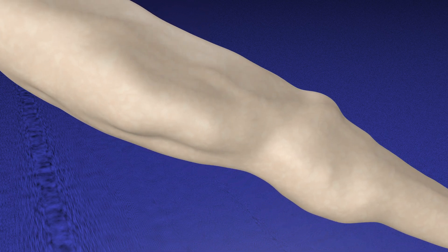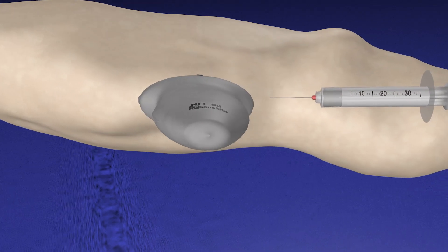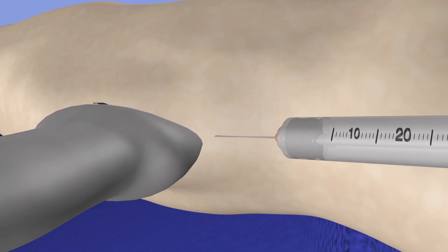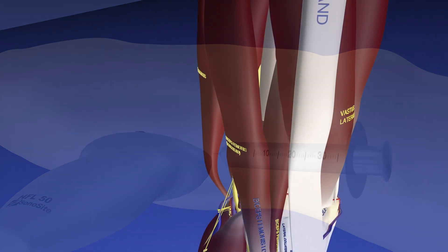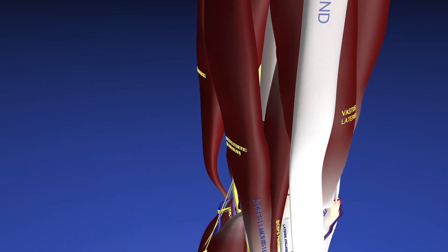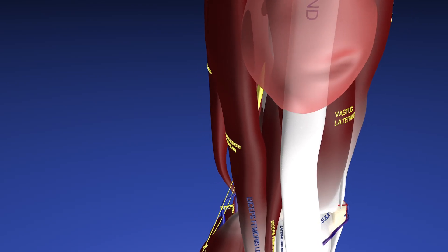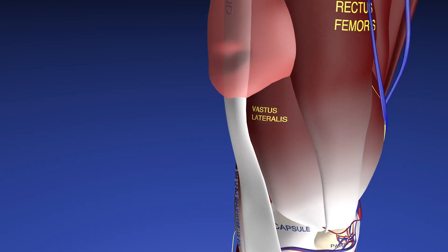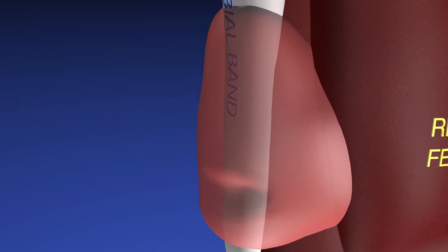Now we're bringing the lower extremity into a supine position, and here's our probe. We're going to approach at the very inferior aspect of this lesion to use gravity to help collect as much fluid as possible. Here we can see the normal anatomy of the lateral thigh — the iliotibial band right above the vastus lateralis — and here's our Morel-Lavallée lesion.